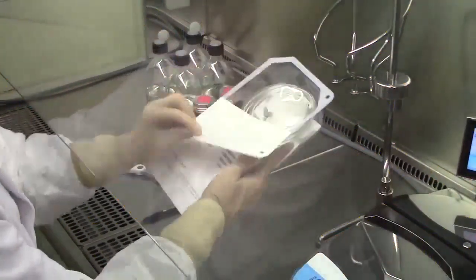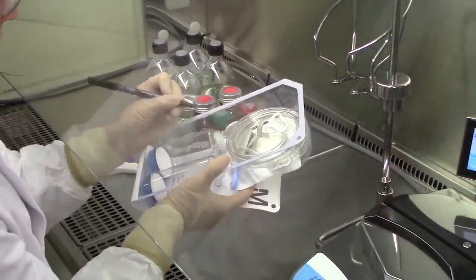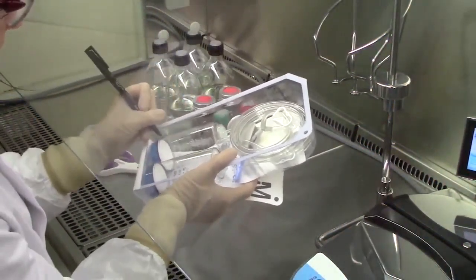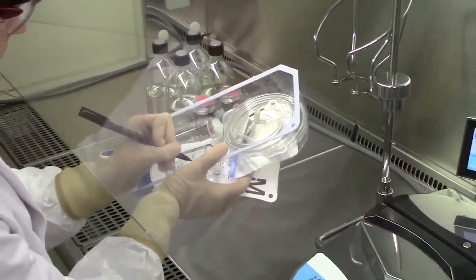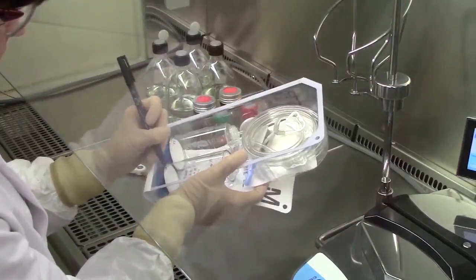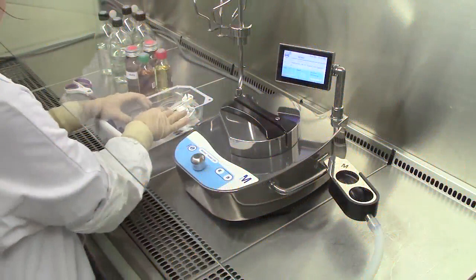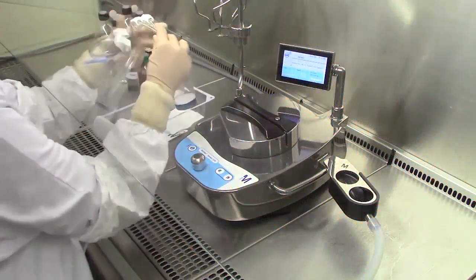Aseptically open the package of the Steritest device in the laminar flow hood. Label the canisters with all relevant information for test identification and interpretation. Remove the Steritest device from its package and insert the canisters into the drain tray.